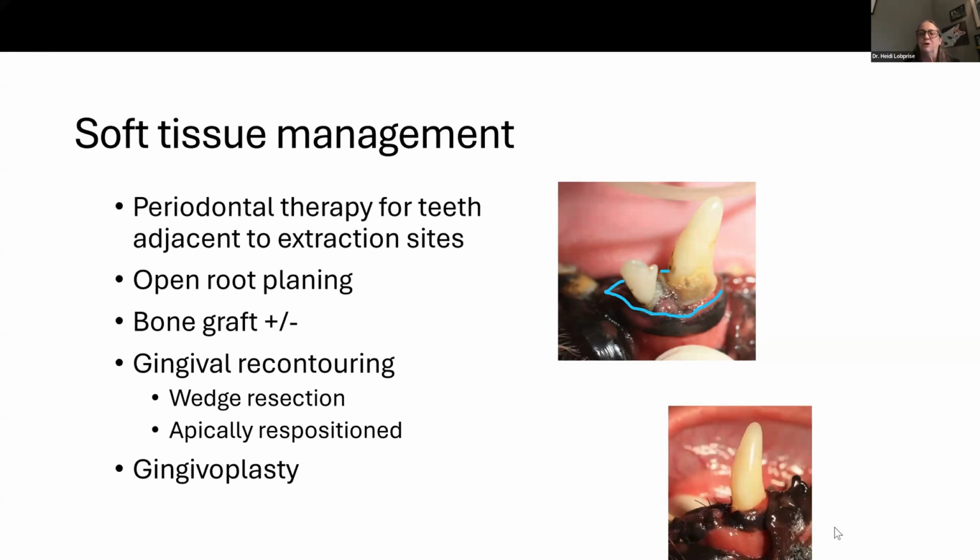And there it is after removing the diseased tissue, the diseased tooth. Now we do have root exposure. I mean, we're not going to get that back. We're not going to get that bone and that gum tissue back on that tooth. People have procedures at times that they can do, but we certainly have a healthier situation.